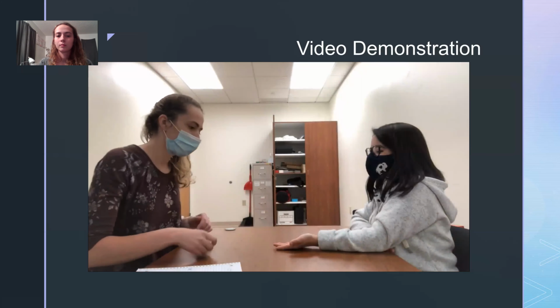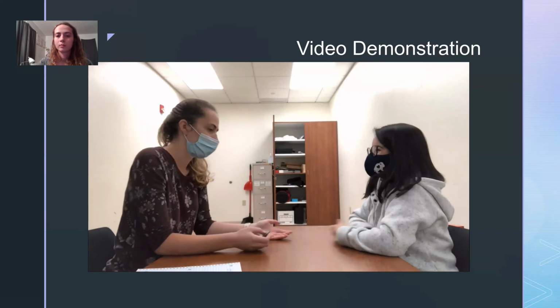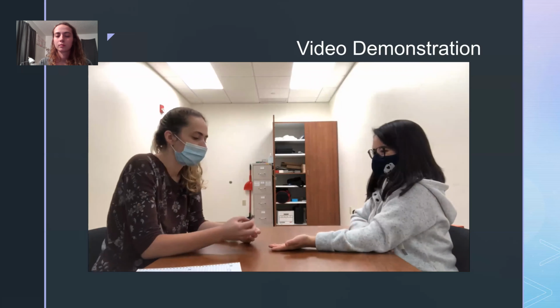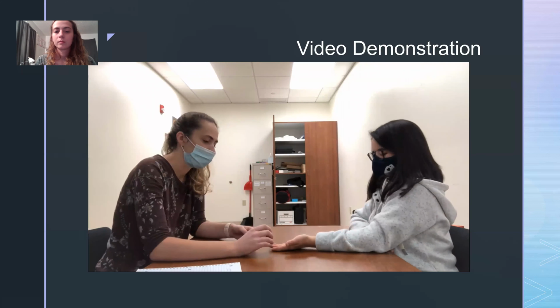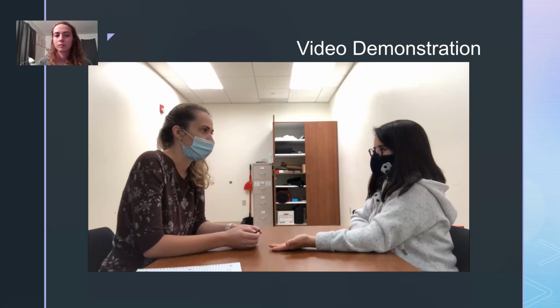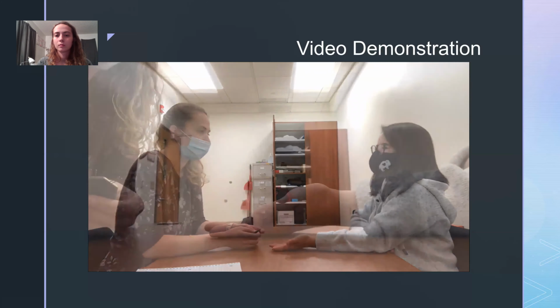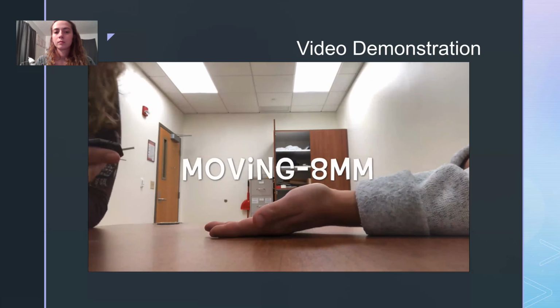All right, Alina, so we just finished the static test, so there's actually also a moving test, so I'm going to have you put your hand out again. So for this test, instead of just poking you with it, I'm going to drag it down your finger like that, and you're going to tell me 1, 2, or I don't know. Does that make sense? Yes. Perfect. All right, Alina, I'm going to have you close your eyes and then we'll begin the test. Okay. Are you ready? Yes.